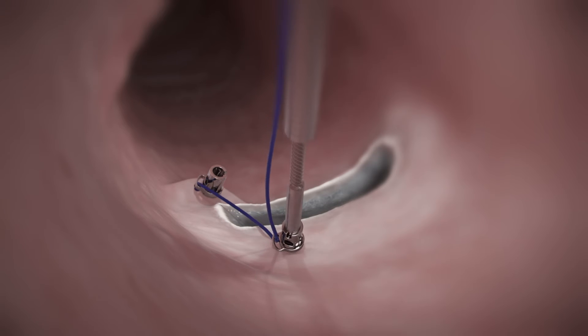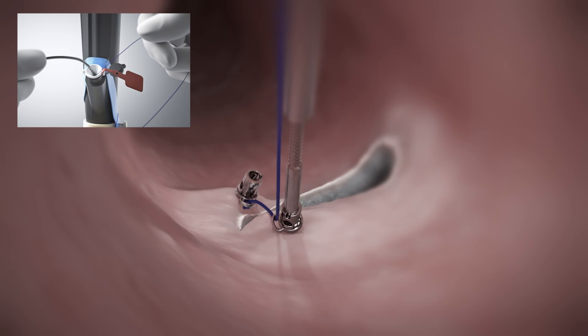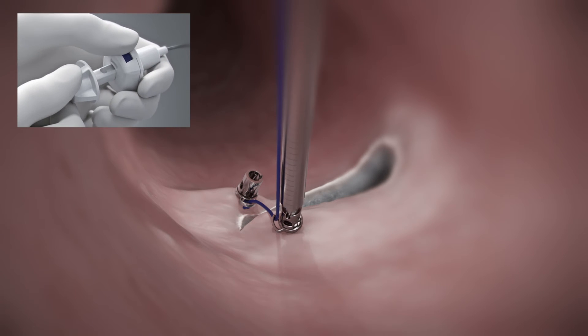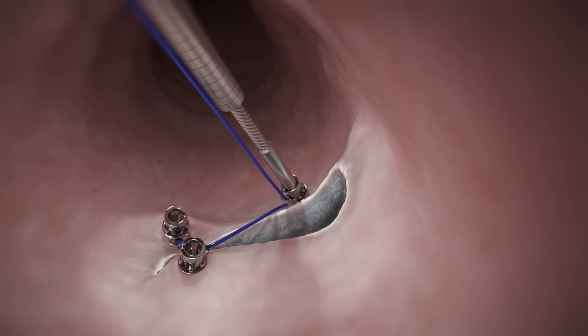Prior to deployment and with the driver still engaged, apply tension to the suture to approximate tissue. Deploy the second helix TAC. Repeat the technique for each additional helix TAC.